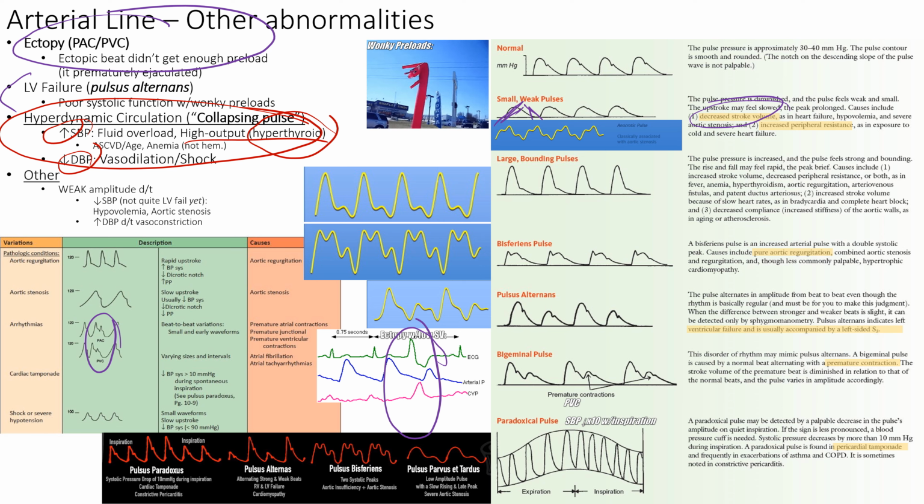Weak amplitude, like we said with CHF, or if someone has valve disease, aortic stenosis or aortic regurg, would you have a weak amplitude? Stenosis, right? With stenosis, you're going to have this fallen over effect, compared to aortic regurg, which is nice and upright. It's super easy to get the blood out. Whereas with aortic stenosis, it's not easy to get the blood out. There's a stenotic valve in the way. So that's the idea behind these, by the A-line waveform.